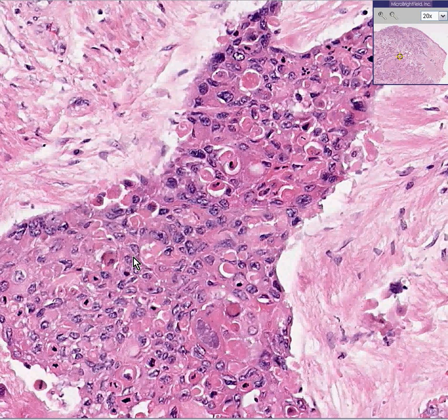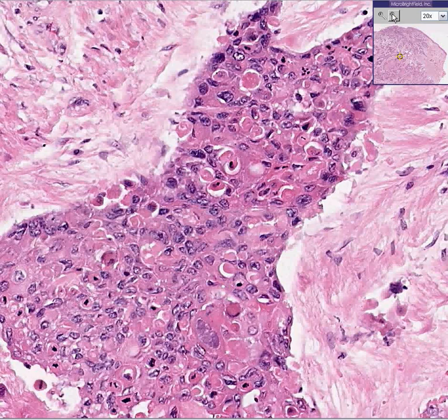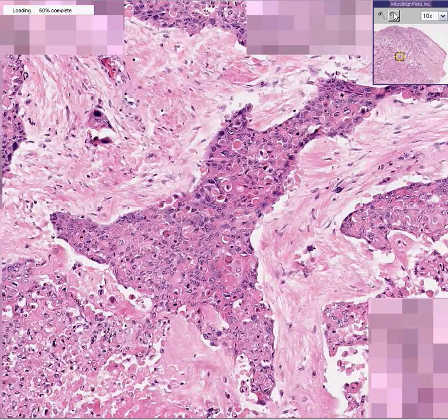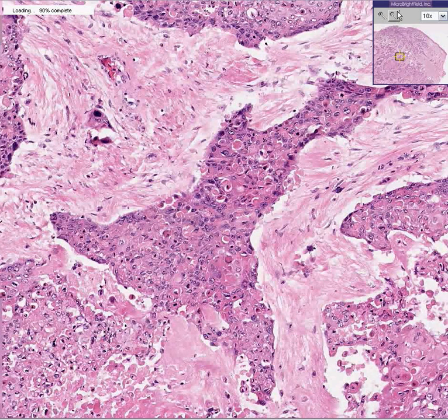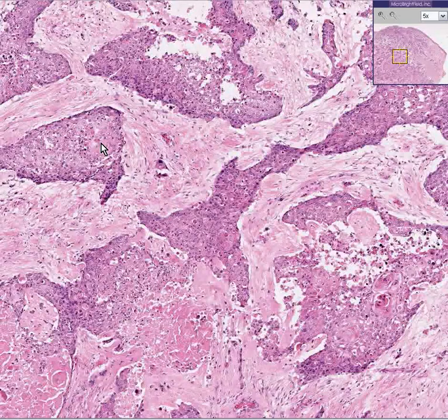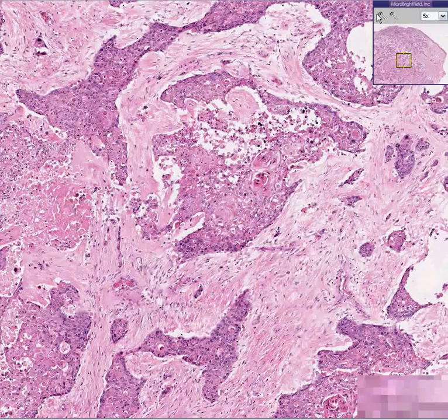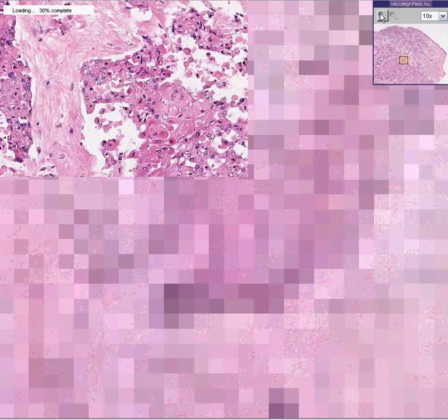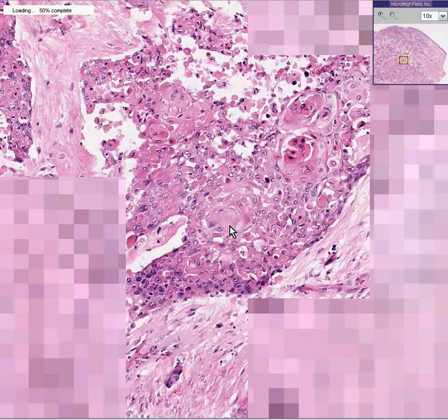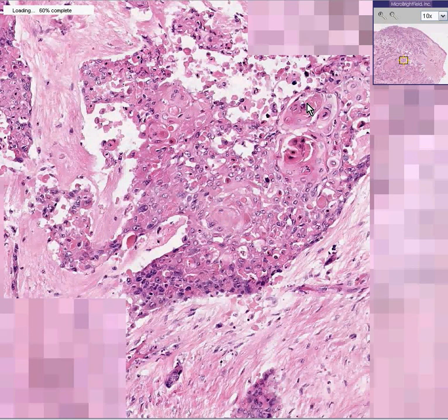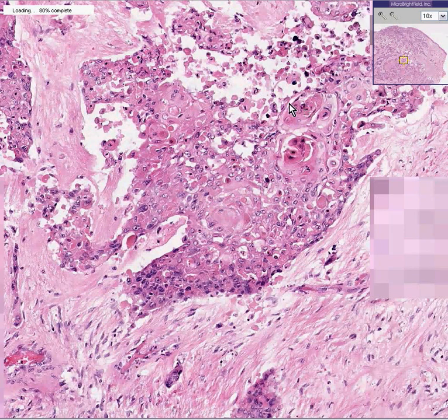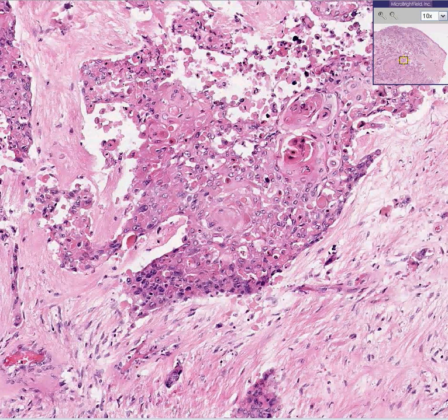But remember, because we saw pearls in certain areas, by definition that would put it into the more well-differentiated category. Let's find a pearl — we already saw a couple of halfway decent ones, and here's a real decent one over here. Look how these cells just kind of whirl to form little tumor nests. Infiltrating squamous cell carcinoma of the tongue. Thank you very much.